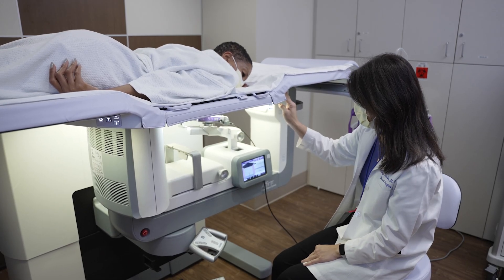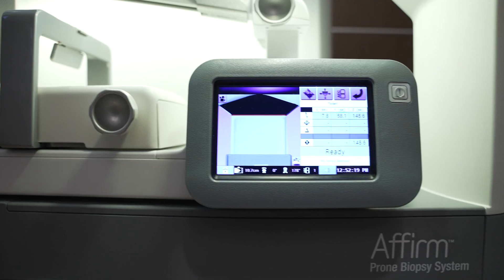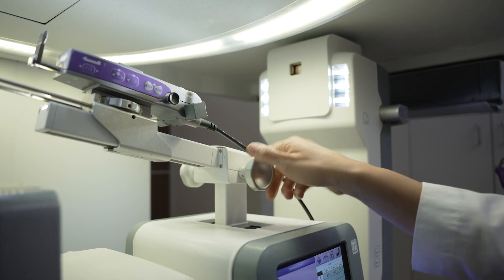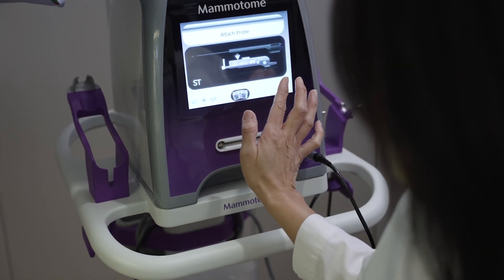The radiologist will apply a local anesthetic, which should numb the entire area. Using computer guidance, a probe will be inserted into the exact location. We use a vacuum-assisted probe to obtain multiple tissue samples of the area.